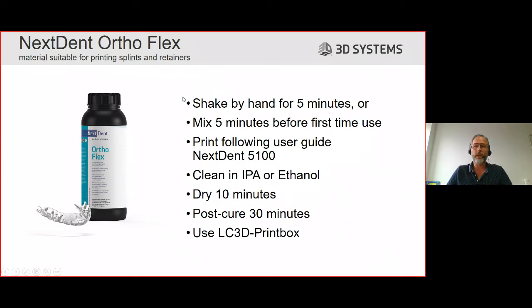After five minutes of shaking the bottle by hand or mixing on the Nexdent mixer, the material is ready to go. After that, you follow the instructions on the printer display - after sending the file from 3D Sprint to the printer, you follow the steps on the display. You check several things, then press the start button and the printing process proceeds.